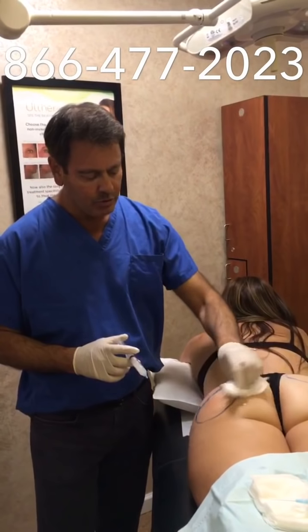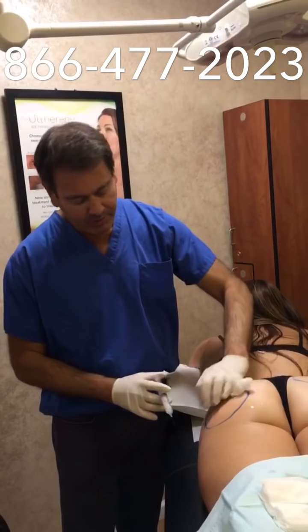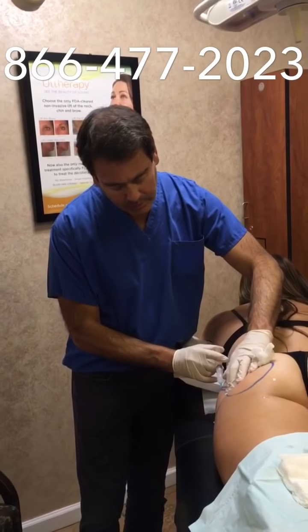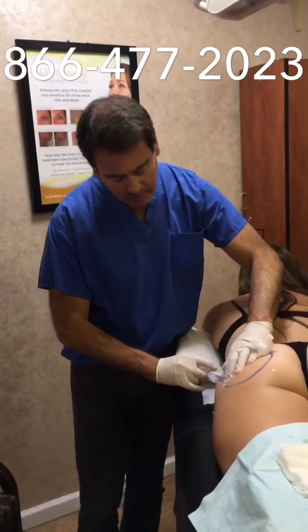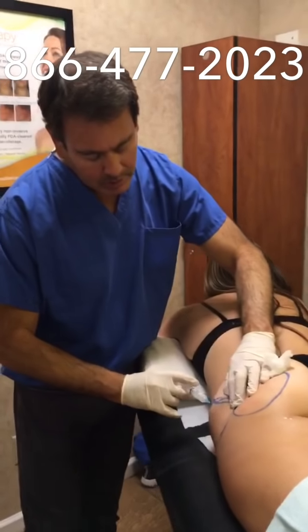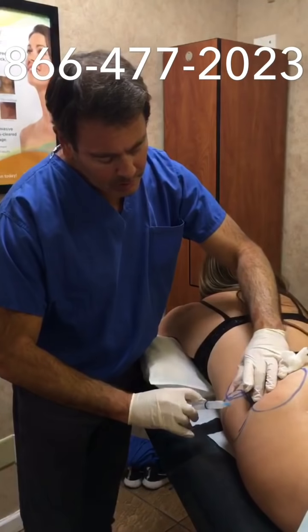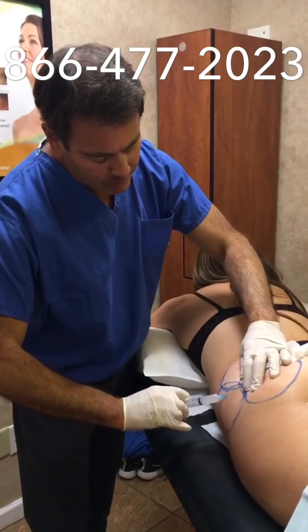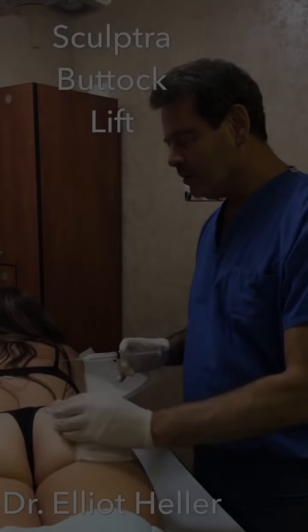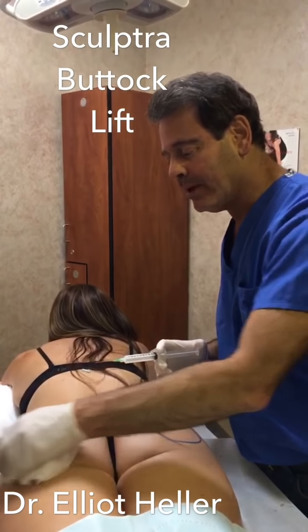We've completed two zones already — the top area and the lower area. Now we're going to fill the sides in towards the hips. This is going to make it a little broader and a little rounder, which looks aesthetically more pleasing. Because we have the lidocaine and novocaine in, it makes it almost painless. We've completed one side of the buttock — three different areas: the top, the bottom, and the side for the hip.